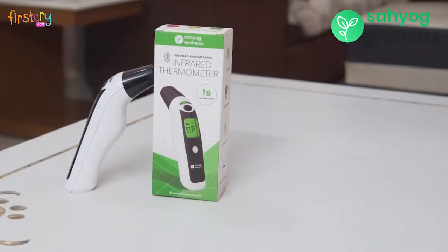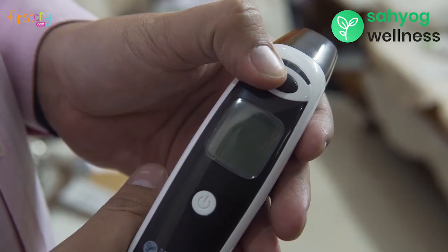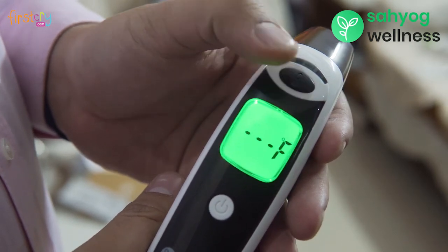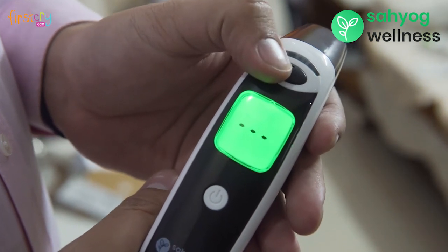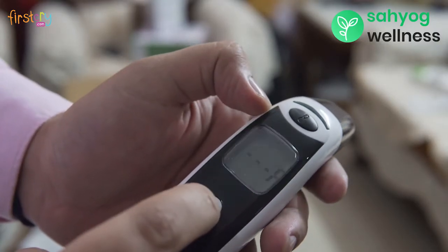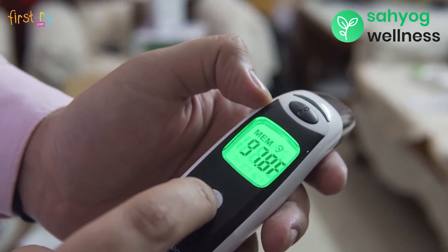To switch the measurement between Celsius and Fahrenheit, turn the thermometer off. Long press the black button for about 5 seconds. The screen displays either C or F. If you want to change it, press the black button from the right side. The temperature unit changes, and when you switch it on, you will get the readings in the desired units.